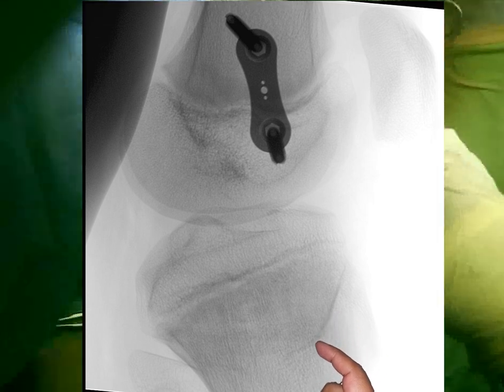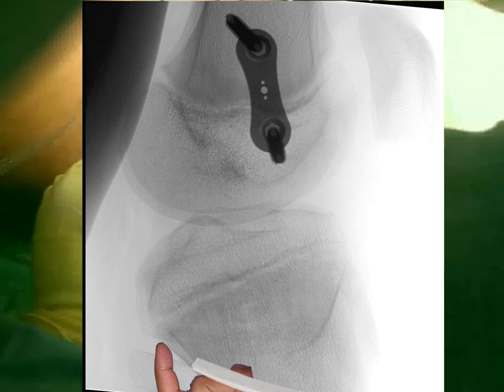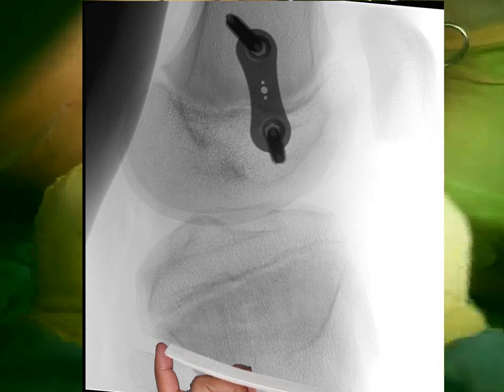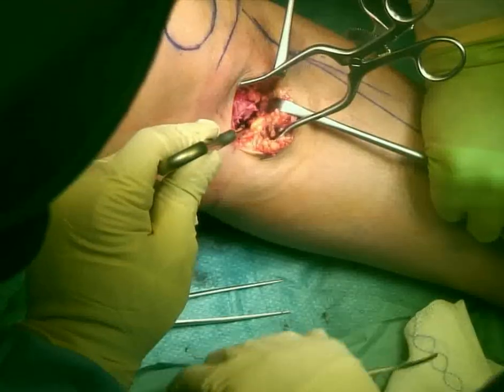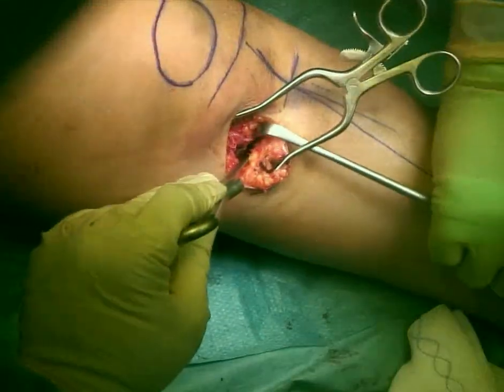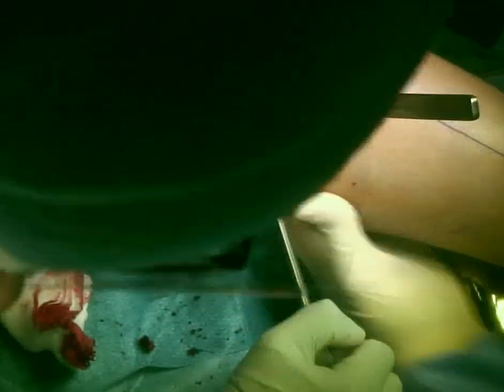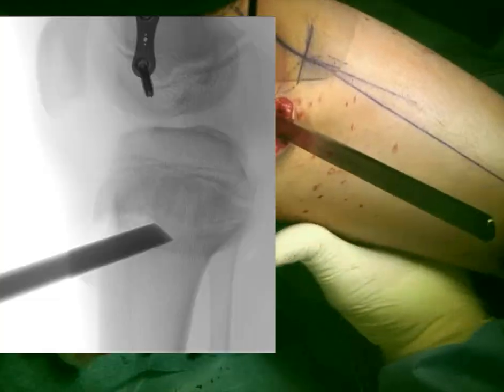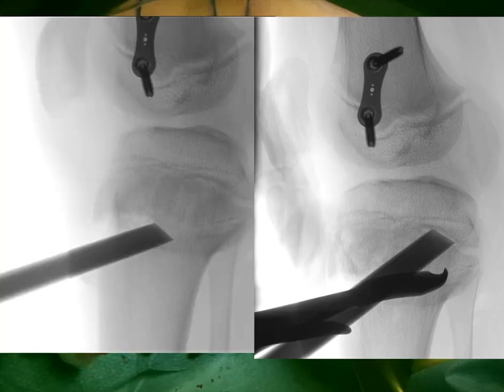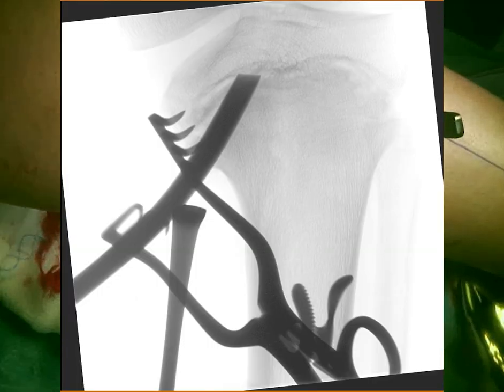And this is important because your finger will guide your osteotomy later to prevent breaching at the back or at the front, and to protect the neurovascular structures in the vicinity. And as you can see here, I'm trying to create a window for my fingers to go behind the bone and in front of the bone for the purpose I just mentioned. Once you are happy with the windows that you created and you can feel in front and behind the bone, you start your osteotomy with various types of osteotomes, whether curved or straight. And here you rely on the x-rays as well as the feeling with your fingers to make sure that you don't endanger any neurovascular structures nearby.